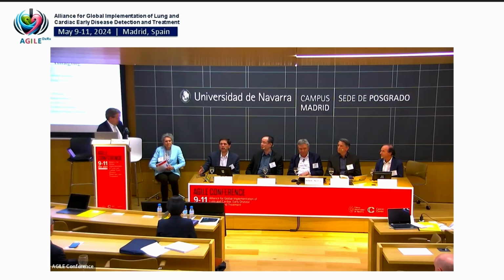So the reason why is because let's take lung nodules, for example. We'll start with solid lung nodules in the range of 4 to 10 millimeters. They typically have very high contrast with respect to the lung parenchyma that usually surrounds them. So noise is not a big issue usually. We don't see failures generally with solid lung nodules due to noise.